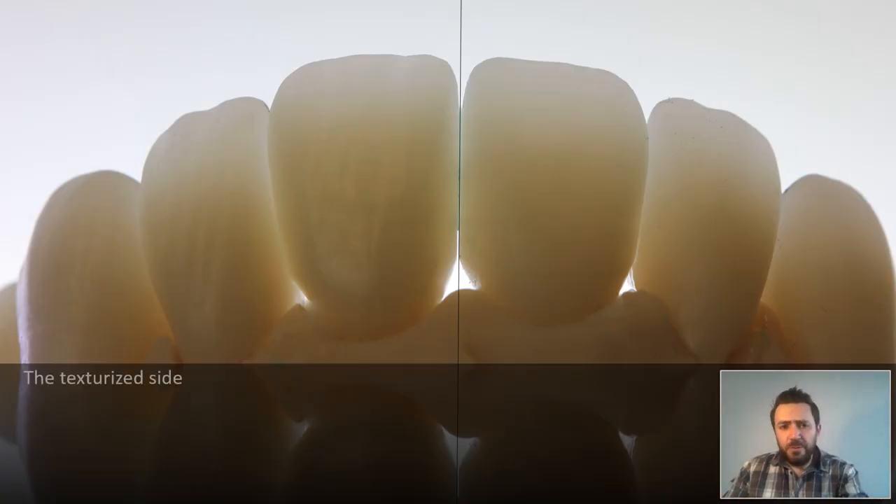One important thing to note: I intentionally do not make much texture on the incisal third. This is very important, because the more texture you create, the more light-reflective you turn the surface. Take a closer look at the two halves of this case — the picture was lit from behind. I took this picture before continuing to texturize the other side to show you that the more texture you put on the surface, the more you increase light reflection and consequently reduce translucency. So keep texture light, especially on the incisal third where a high degree of translucency is important to make a monolithic crown look as close to natural as possible.